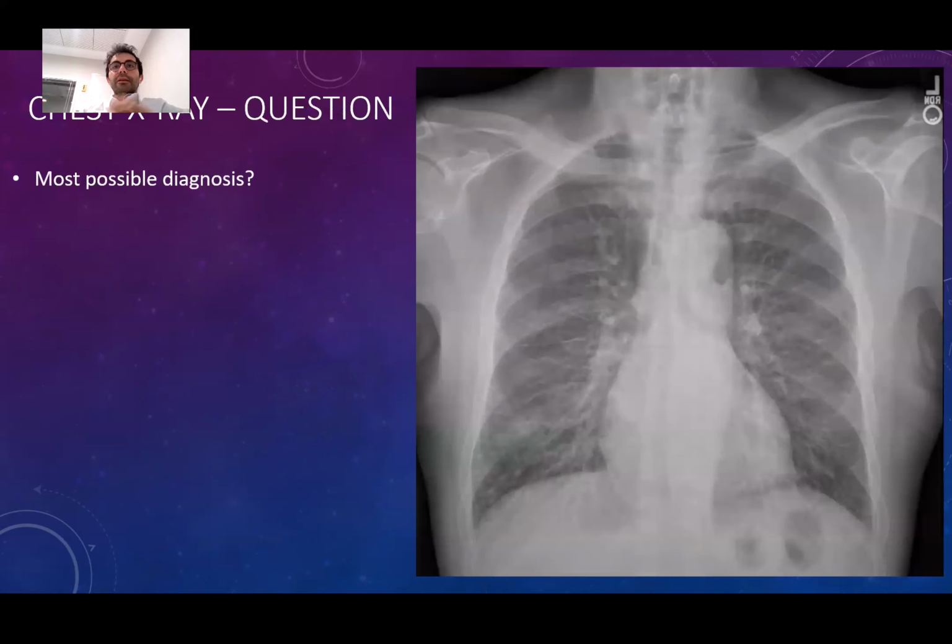Without looking at the clinical picture, a chest X-ray doesn't tell you everything. Sometimes, for example in pneumothorax, you see it right away. But for airspace opacities, a lot of diseases intersect with each other. I hope that answers the question.